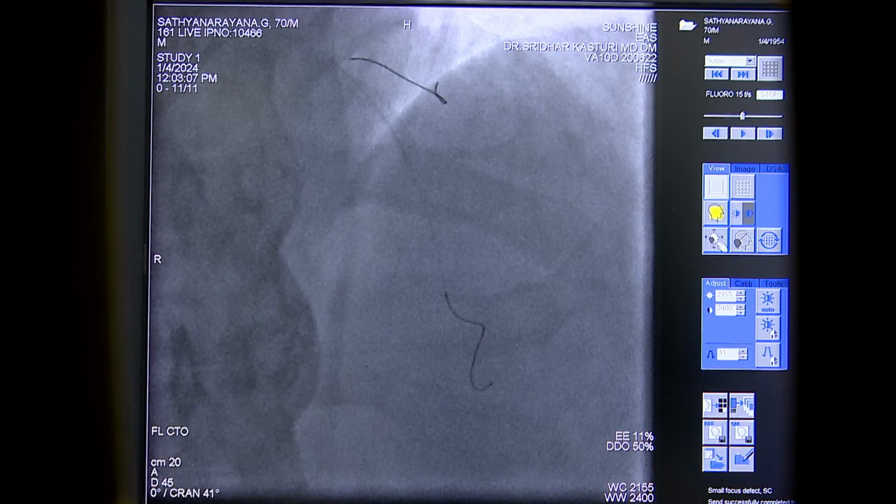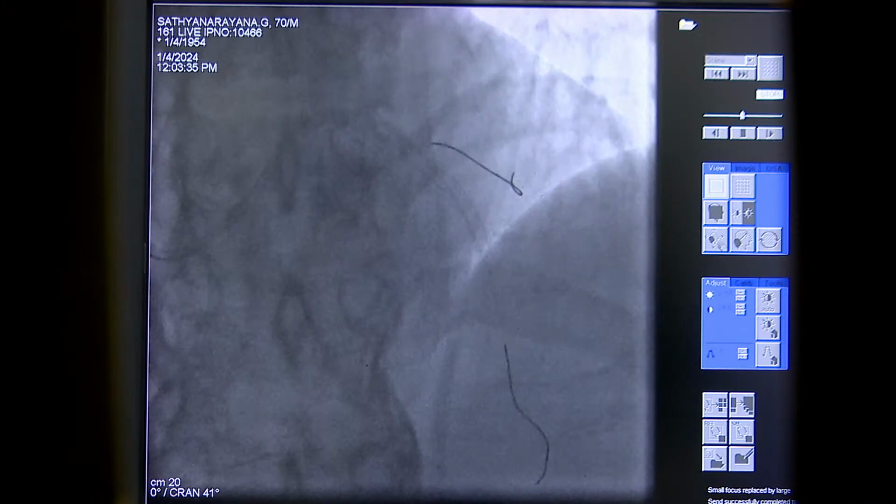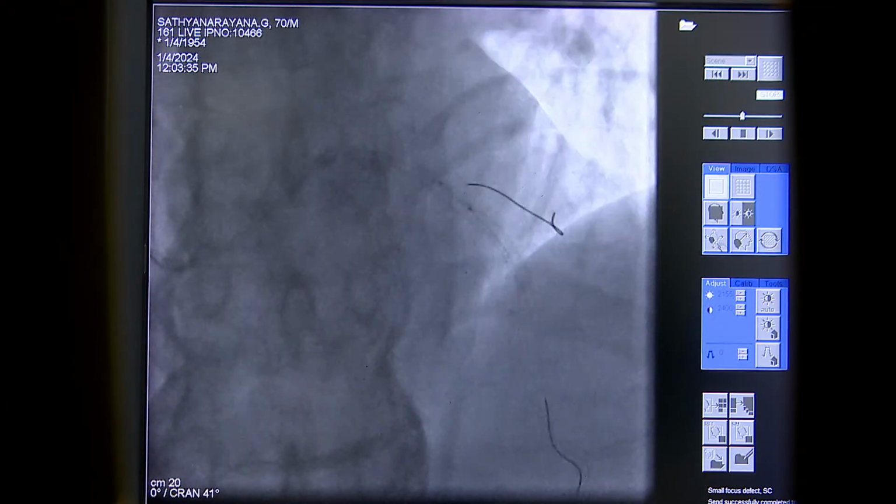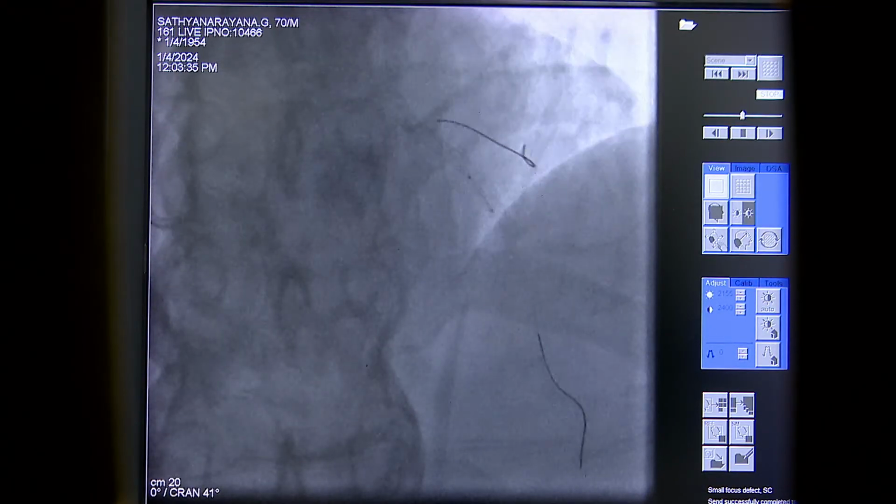Will it come from distal to proximal? Distal to proximal. Distally go with very nominal pressure. Only 6, maintain 6. Distal 6, then mid go to 8. Then proximally we will go slightly more. Just avoid the last 1 to 2 mm.